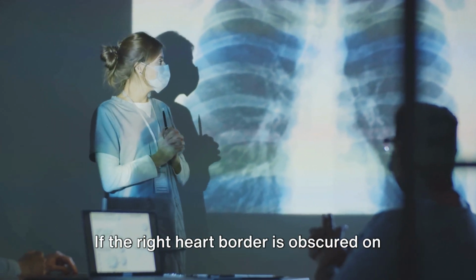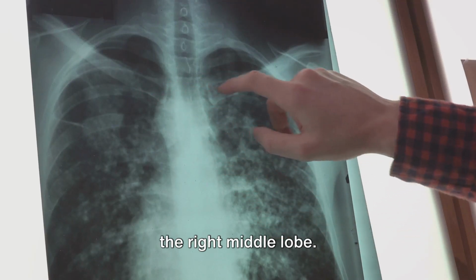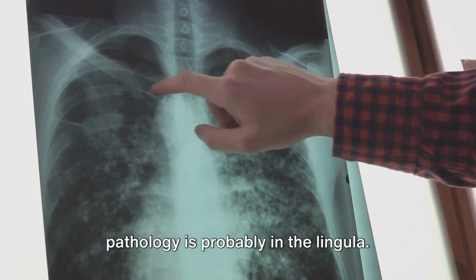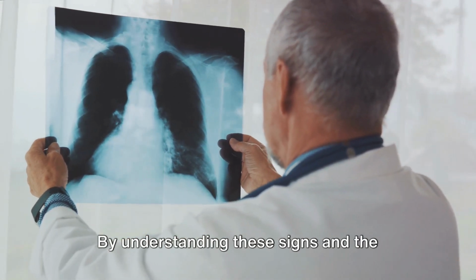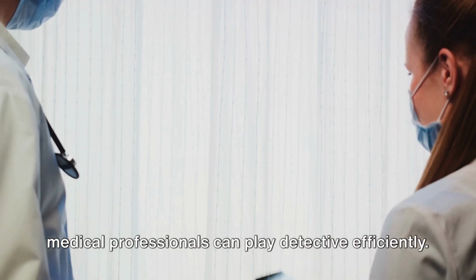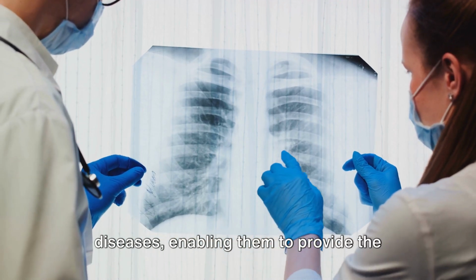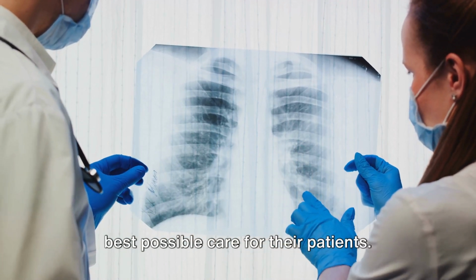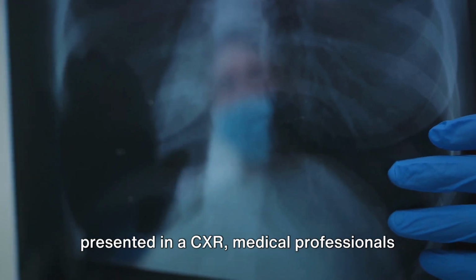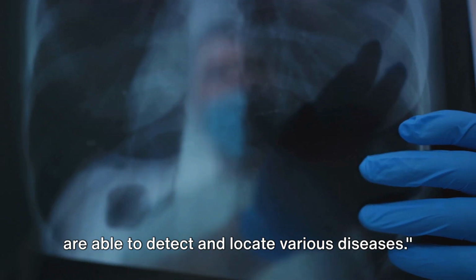If the right heart border is obscured on a chest X-ray, the pathology is likely in the right middle lobe. If the left heart border is obscured, the pathology is probably in the lingula. By understanding these signs and the anatomy presented in a chest X-ray, medical professionals can play detective efficiently. They can detect and locate various diseases, enabling them to provide the best possible care for their patients.